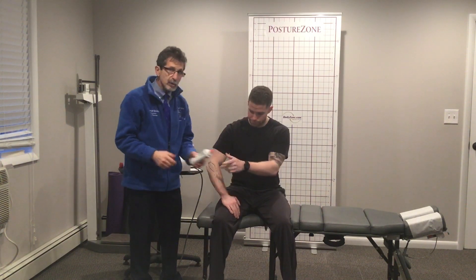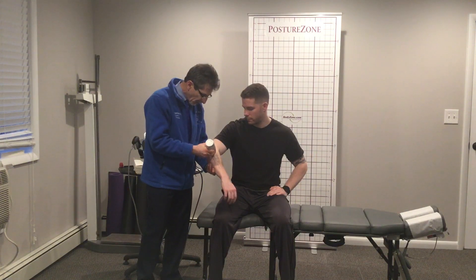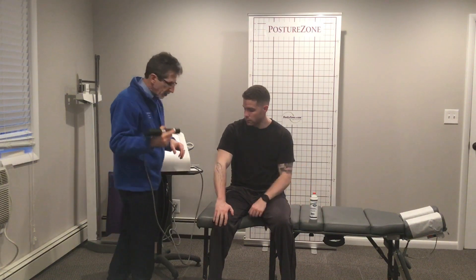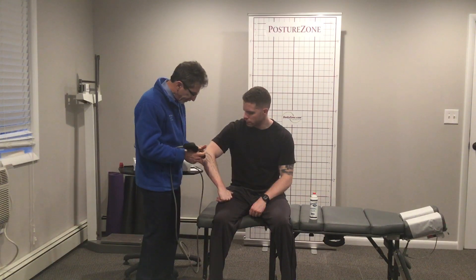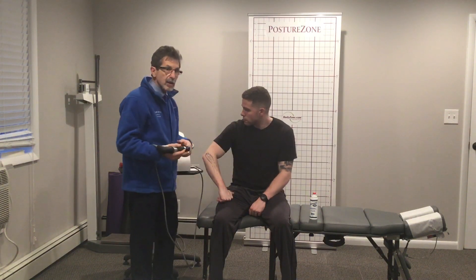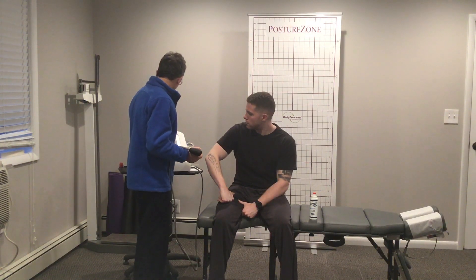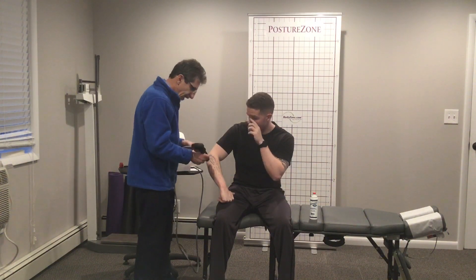How we're going to treat that today is with radial shockwave therapy. We're going to use the Chattanooga 2RPW machine — it's a radial pulse wave, air-driven as opposed to electromagnetic. We're going to set it up to get some increased circulation and stimulate healing. For a relatively inflamed but chronic situation, I would probably only do maybe 1.2 bars, 18 hertz — really fast.